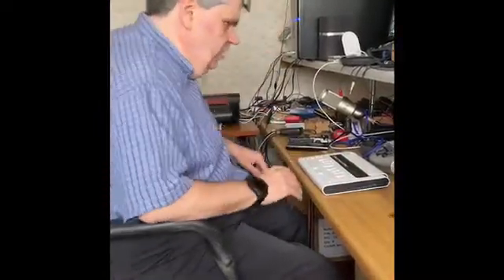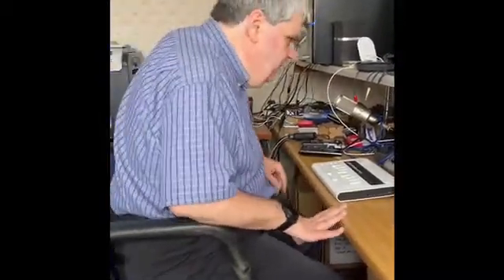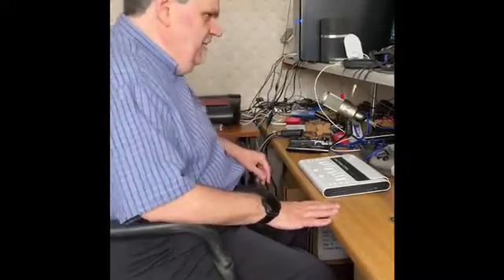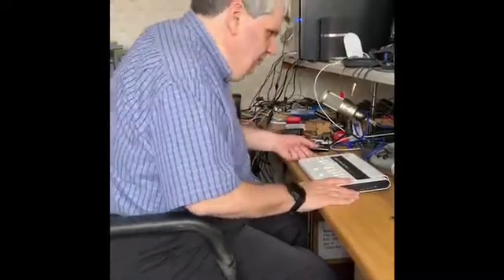I can actually load Microsoft Word, and I can load Microsoft Outlook and read Braille, read the note taker on that as well. So what I'm trying to say is, Windows is the most popular, isn't it, in terms of in schools, most people have Windows as opposed to anything else. So this note taker is up there with that.